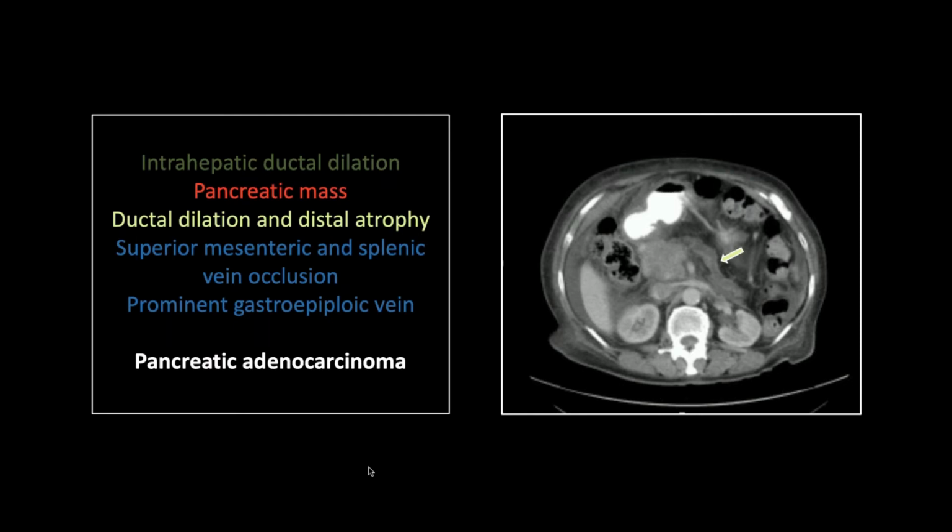When I see a pancreatic mass, sometimes the mass itself can be really tough to discern, and it looks almost like a contour abnormality. And the thing that tips you into saying that's a carcinoma is the presence of ductal dilation or distal pancreatic parenchymal atrophy. I have been there a dozen times, and I can tell you it can be an extremely helpful hint. Right? Obviously not necessary here because that mass is distinct, large, and the degree of ductal dilation and atrophy are such that no one could miss it.